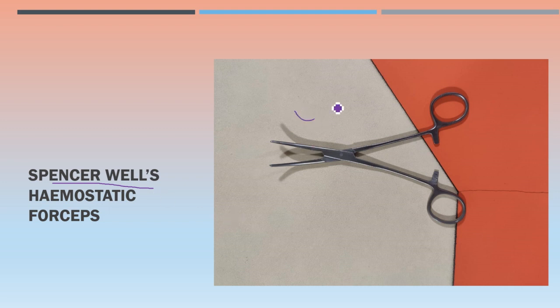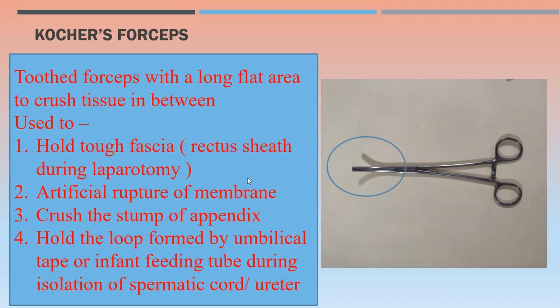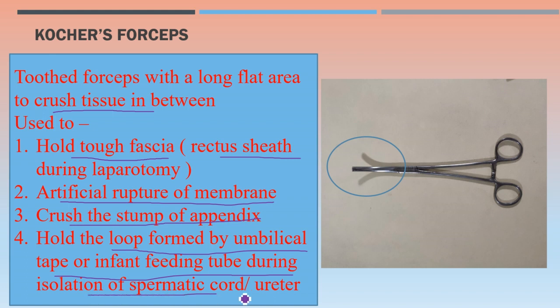Next is Coaches forceps — toothed forceps with a long flat area in the distal segment, and this long flat area is for crushing the tissue in between. Various uses: to hold tough fascia like rectus sheath during laparotomy, in cases of artificial rupture of membranes, for crushing the stump of the appendix, and to hold the loop formed by umbilical tape or infant feeding tube during isolation of the spermatic cord or ureter.